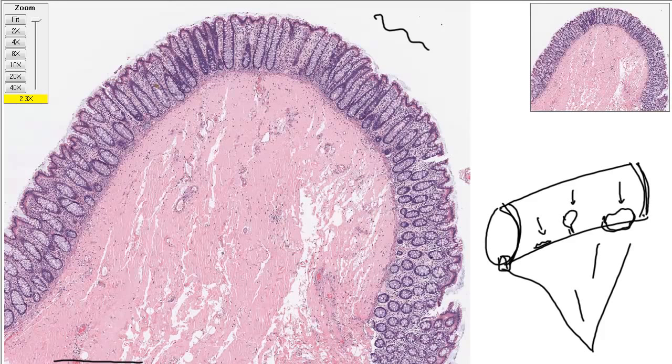And just to get my own bearings, this polyp, this isn't even a polyp. No, this is just regular tissue. A little bit of a fold, but this isn't a polyp. So this distance right here, what would that be, like a centimeter? About like that. It'll probably be, if I had to guess, 5 or 6 millimeters based on the size of the glands. Half a centimeter.